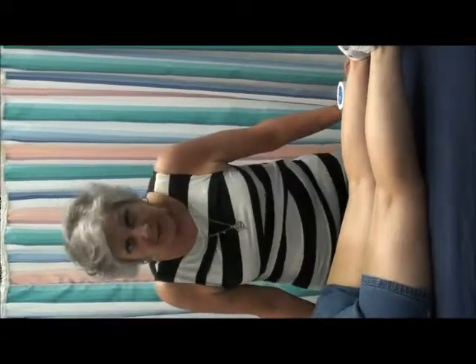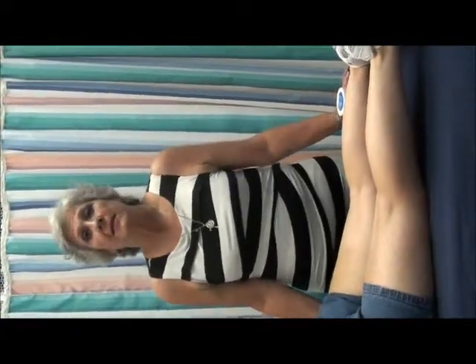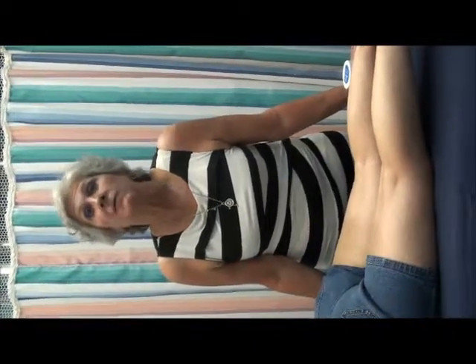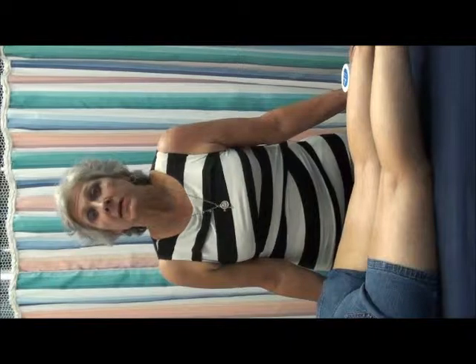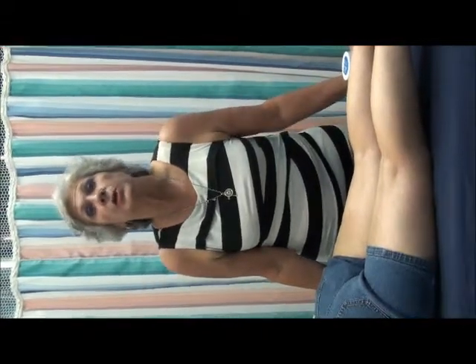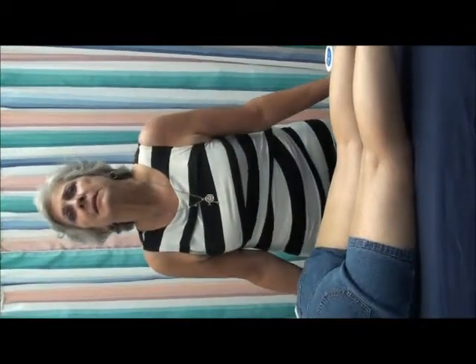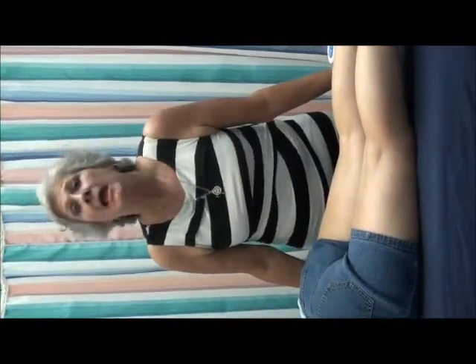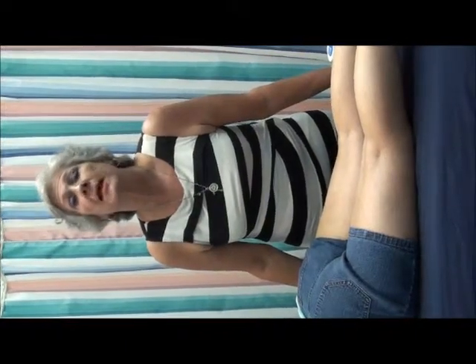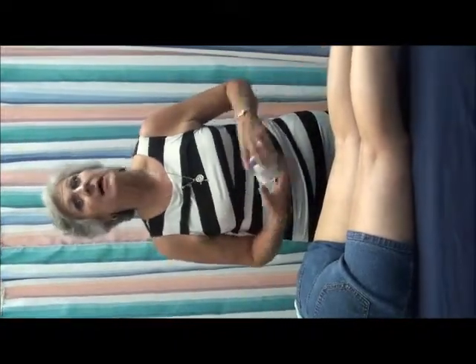I have actually found, even though I wouldn't have expected it, that Graston technique works quite well in quelling the pain of osteoarthritis. Now, in osteoarthritis, I would do both sides. I do the quadriceps and the hamstrings, but for the purpose today, I want to show you how I do the hamstrings. In general, the hamstring muscle tends to be quite tender, has a lot of strain to it, and gets very tight.